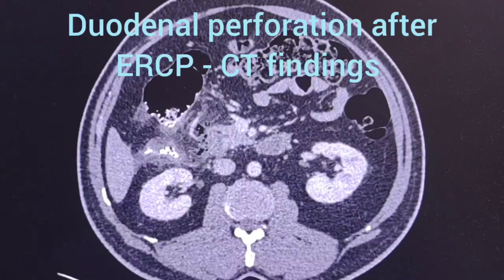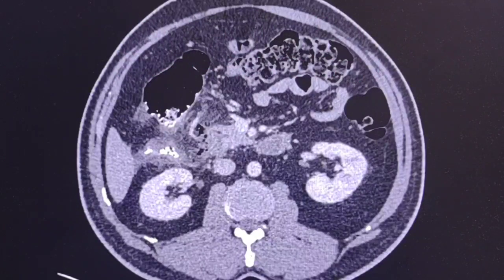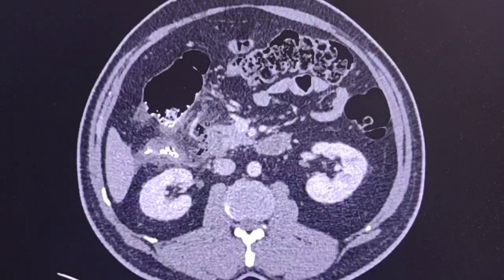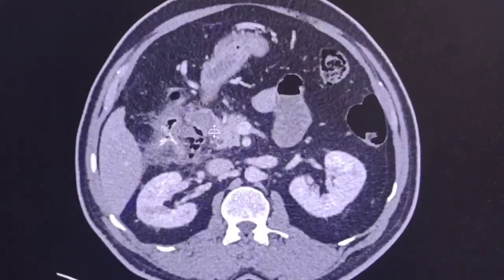This is a case of a 48-year-old male patient who underwent ERCP 24 hours ago and presented with significant abdominal pain, vomiting, tenderness in the upper abdomen, and deranged LFTs. A CT scan was done to rule out perforation. Let's see the images.